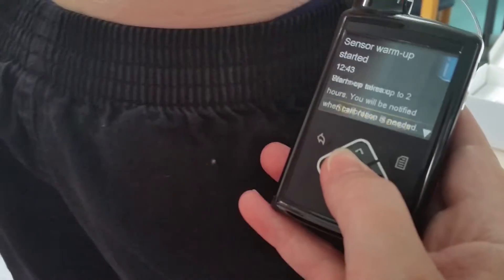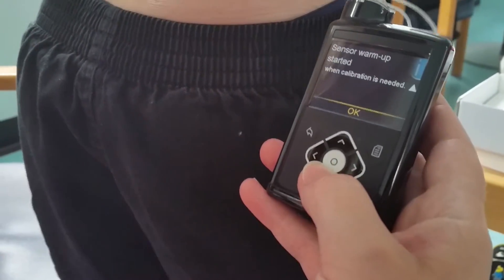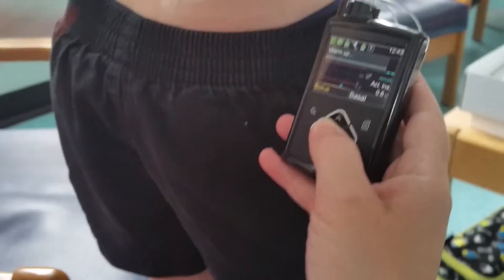If you look on the pump it says 'start new sensor.' If you press the down arrow, the sensor is warming up. I'm going to talk to you about calibration.